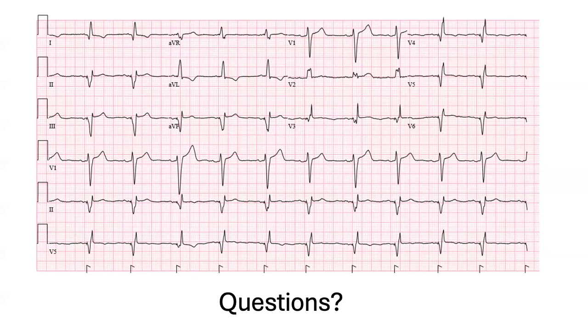Yeah, so voltage is usually associated with PNS or diaphragmatic stimulation. So you can extend the pulse width out and lower your voltage output while still getting capture, and you will avoid the instance.